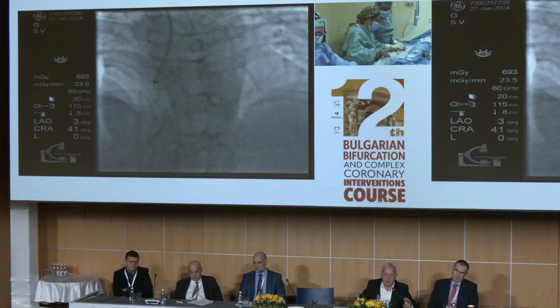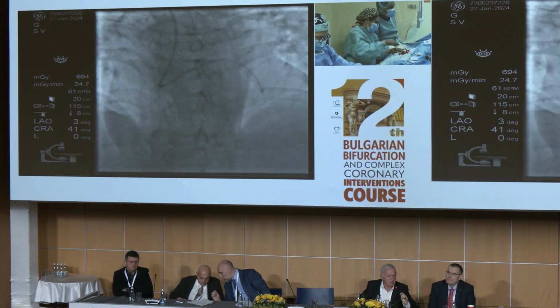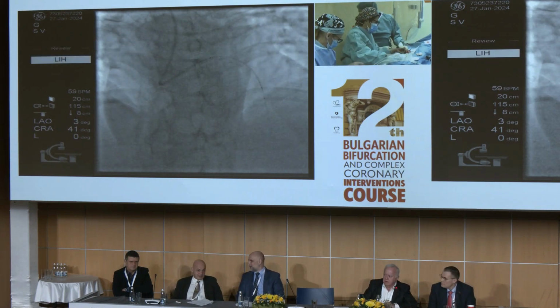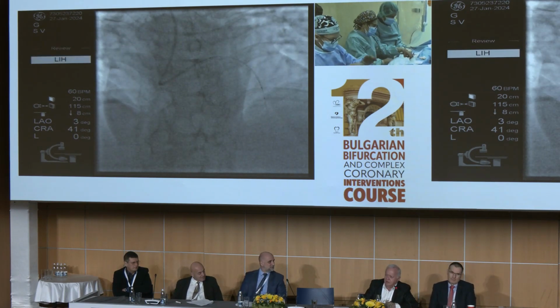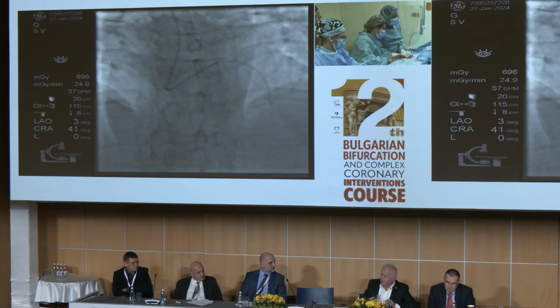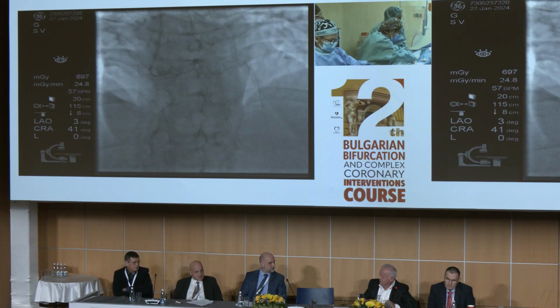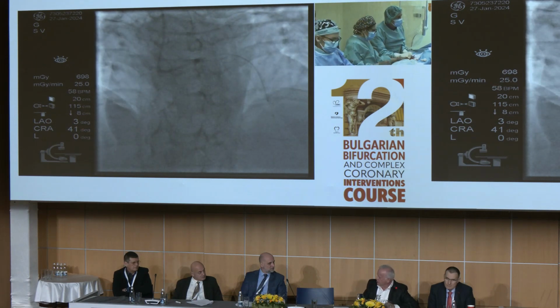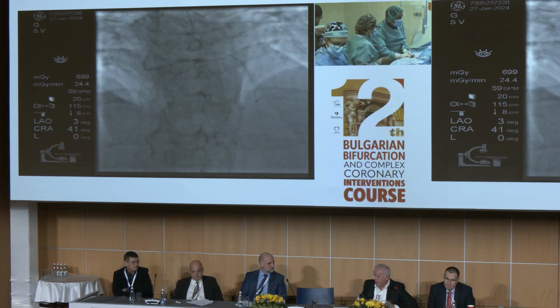Another piece of information is that the KISS trial was shown yesterday, by Bernard Chevalier, my associate, telling that kissing is not giving any advantage when there is no tight lesion in the ostium of the diagonal branch, the side branch.